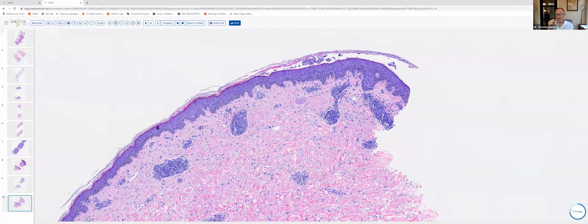Anytime you're dealing with a spongiotic or eczematous dermatitis on volar surfaces, one should think about dermatophytosis. And finally, if you've got a psoriasiform dermatitis, one with epidermal hyperplasia and a compact cornified layer, make sure you look for the presence of dermatophyte.